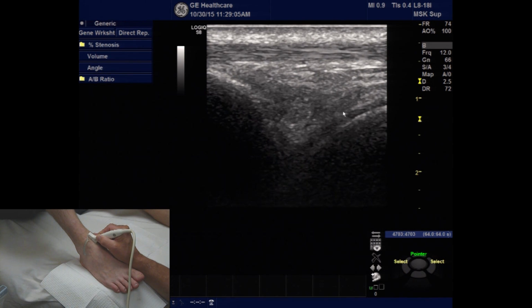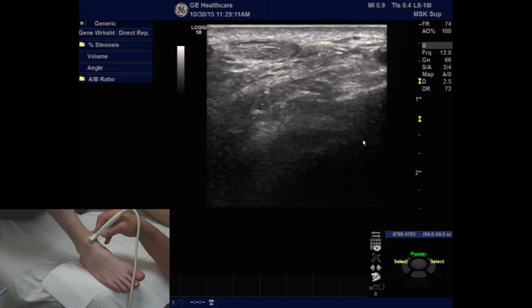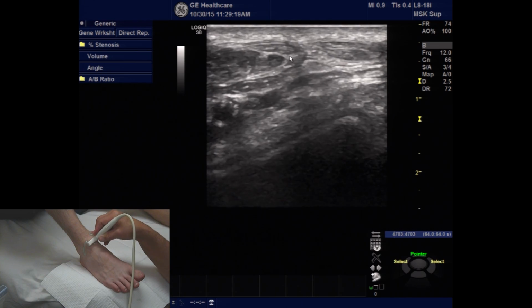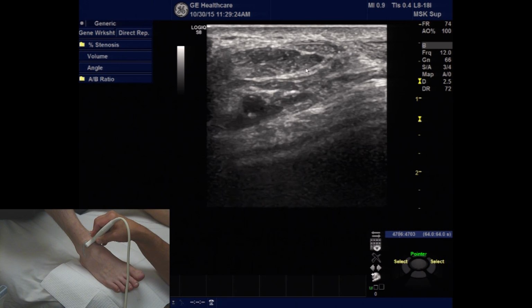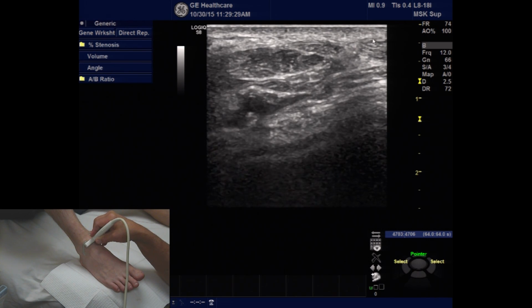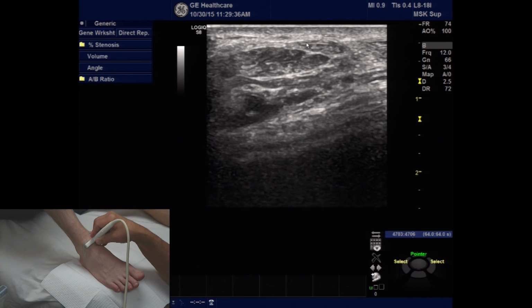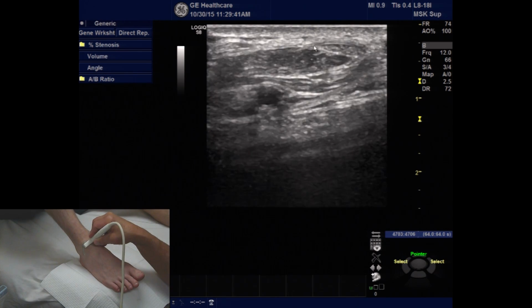Once again, rotating my transducer back into the short axis plane, I have the anterior tibialis, or tibialis anterior, in its short axis. Moving the transducer to the lateral aspect, you'll see the myotendinous portion of the extensor hallucis muscle and tendon. Superficial to that, you'll see some fibers as I move my transducer back and forth.